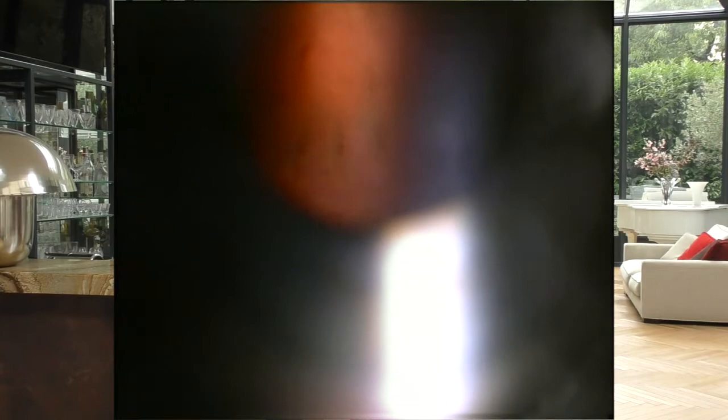I will therefore reserve this lens for cases where one does not want or cannot have contact with the patient's eye, that is to say, essentially, for the immediate post-op. On the other hand, we can use this absence of contact with the eye to judge, in case of doubt, the vitreous attachment of the retina by dynamic maneuvers, asking the patient to move the eye.